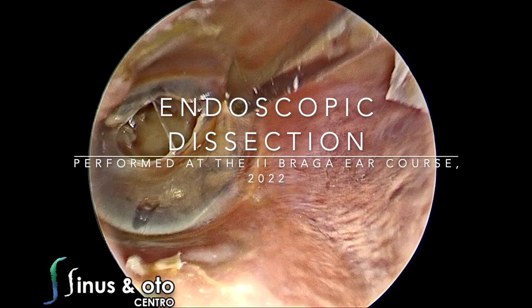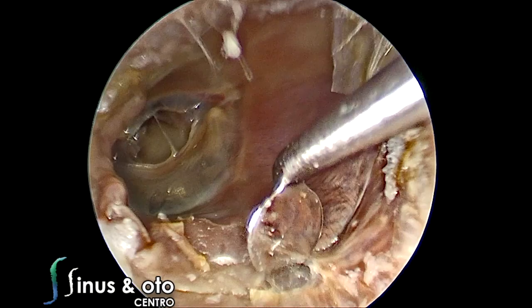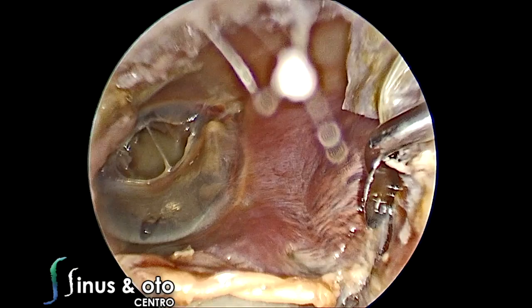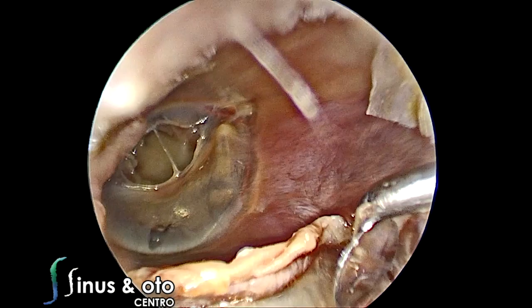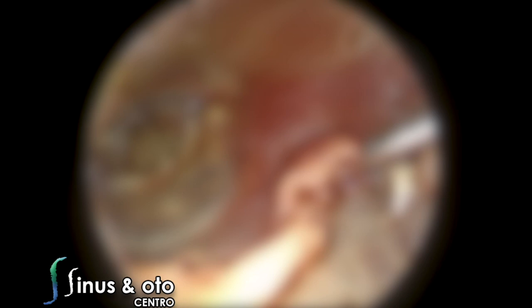Hello, this is Dr. João Flávio Nogueira from Brazil. I will post a series of two dissections — one endoscopic, which is this one, and another one that I strongly recommend you to see, which is microscopic. The endoscopic dissection will focus on the middle ear and also the inner ear. The microscopic dissection is a very complete dissection, showing different types of approaches, including retrofacial approaches and other approaches.